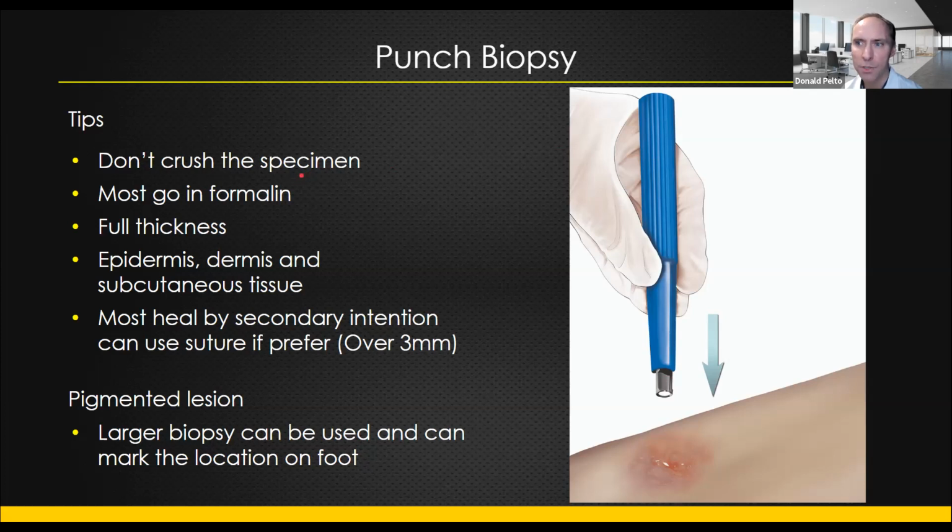I tend to use a tissue nipper, get in there underneath it, and kind of remove it. I try not to grab it with a forceps. It has to go into formalin. It's full thickness, so it's epidermis, dermis, and subcutaneous, so you can see the fat.